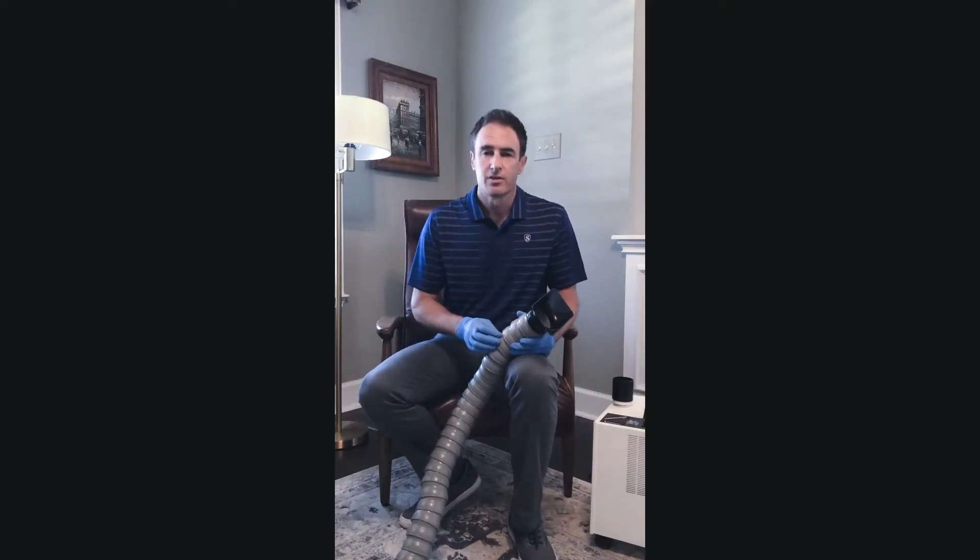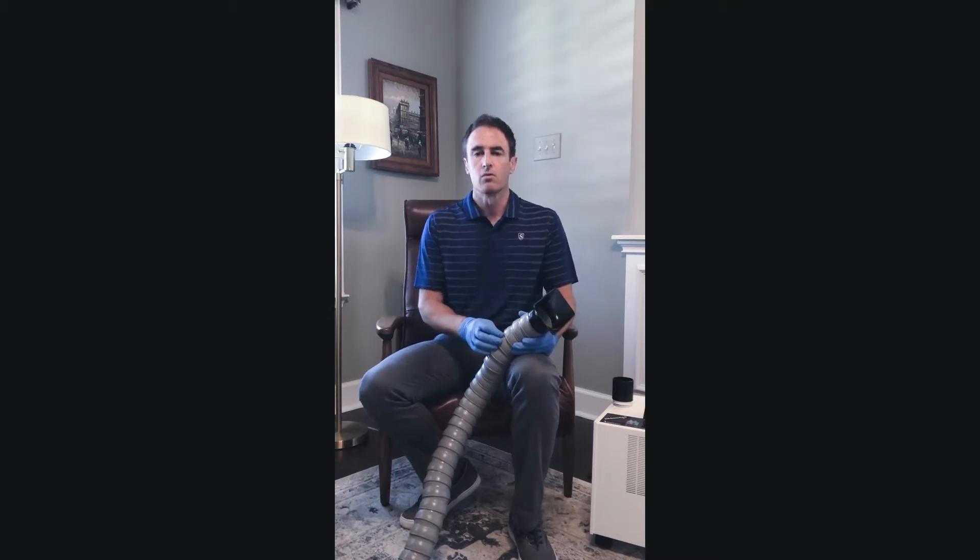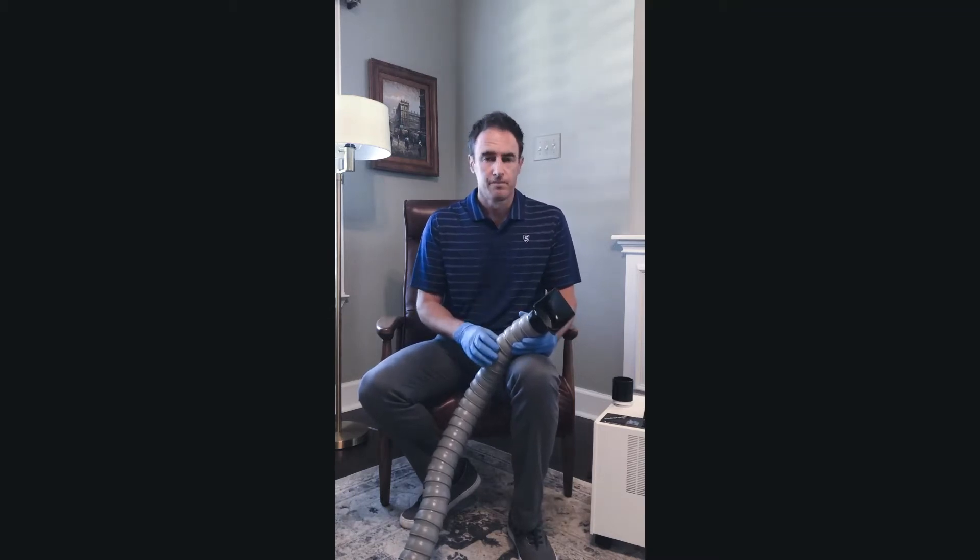Hi, my name is Jim Miller with Vanaman Manufacturing and I'm the product specialist for the Vanguard Gold Mobile Extra Oral Suction Unit. I'm going to give you a quick tip on how to remove the capture mouth from the unit.